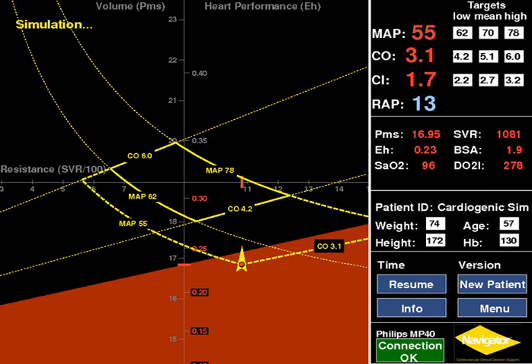Thirdly, the patient's status or position is identified by a red dot and arrow at the intersection of the yellow broken MAP and CO lines extending from the PTZ. The goal of therapy is to move the patient into the PTZ.